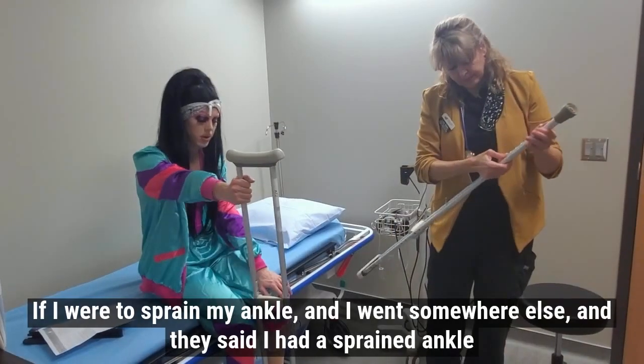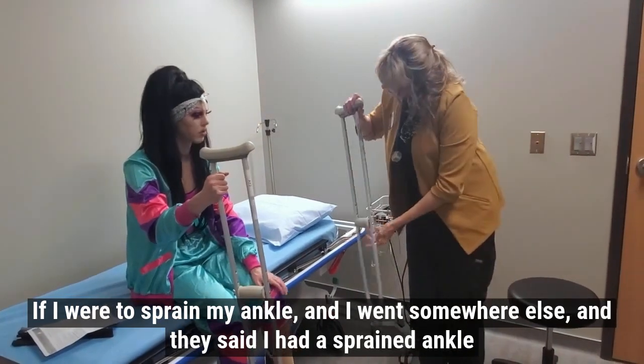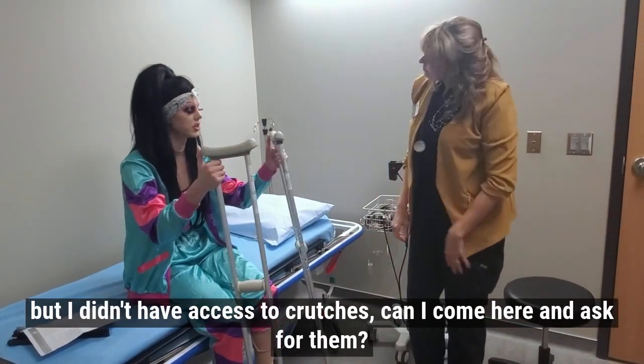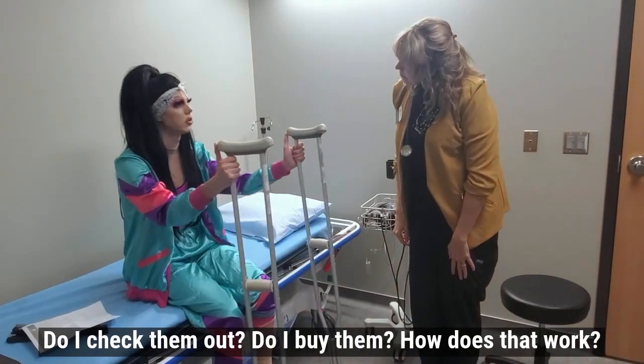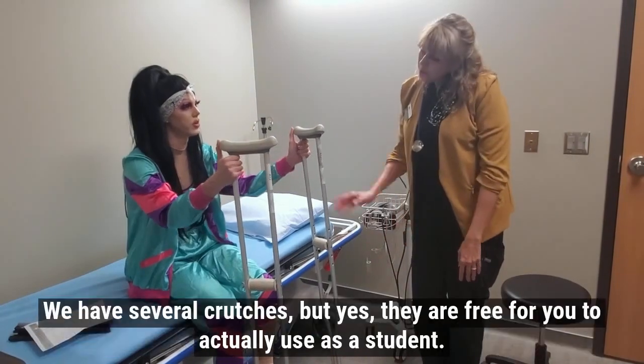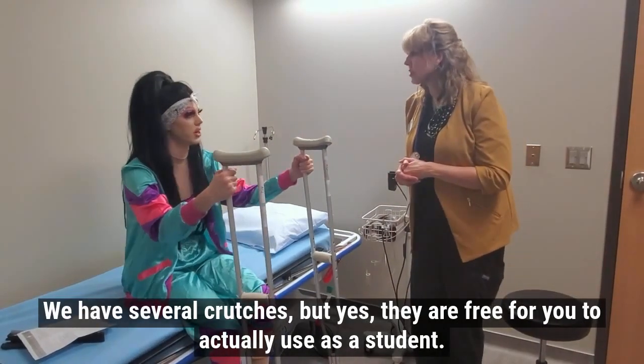If I were to sprain my ankle and I went somewhere else and they said I had a sprained ankle, but I didn't have access to crutches — can I come here and ask for them? Do I check them out or do I buy them? Yes, we have several crutches, and they'll be free for you as a student.